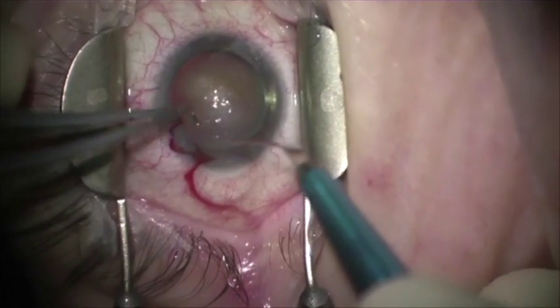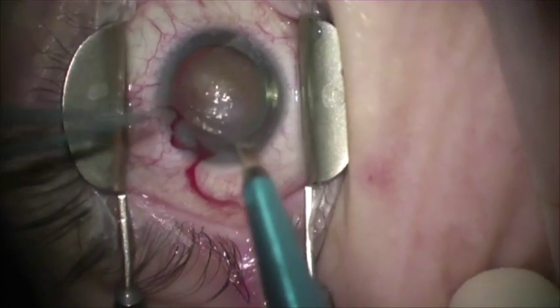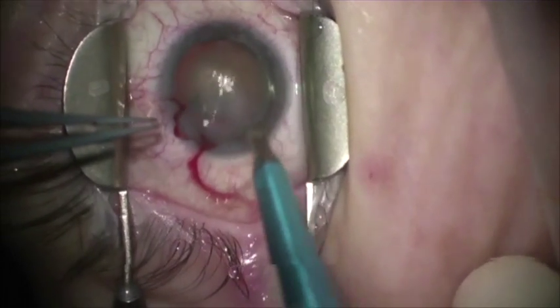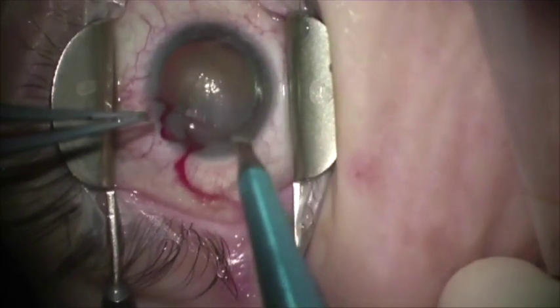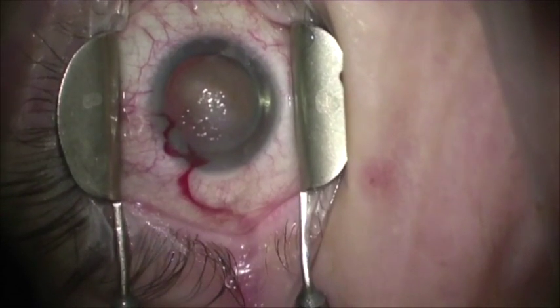Sometimes I'll do this at the end of surgery if I feel like I can do the surgery adequately through the cornea, but feel that it might be visually significant for the patient. In this case, it was both visually significant for the patient as well as for the surgeon.